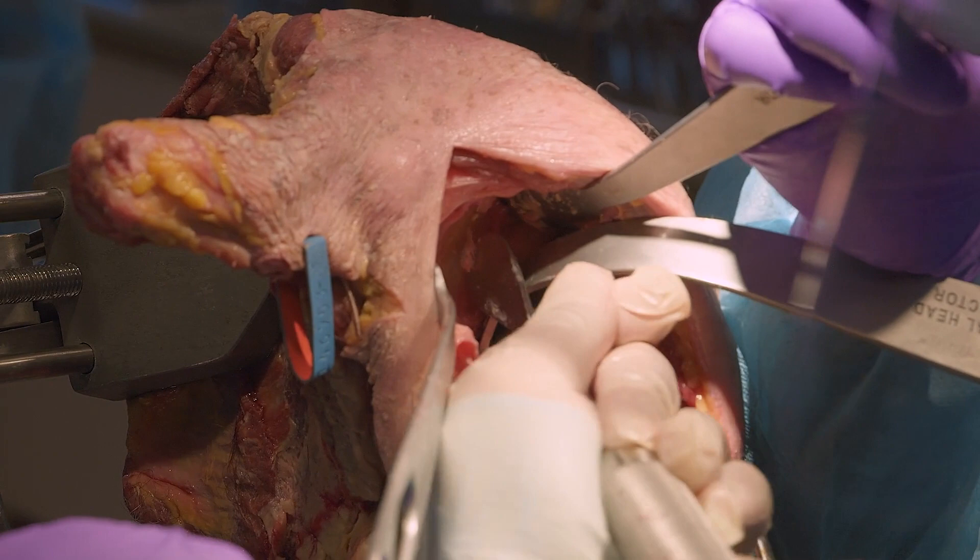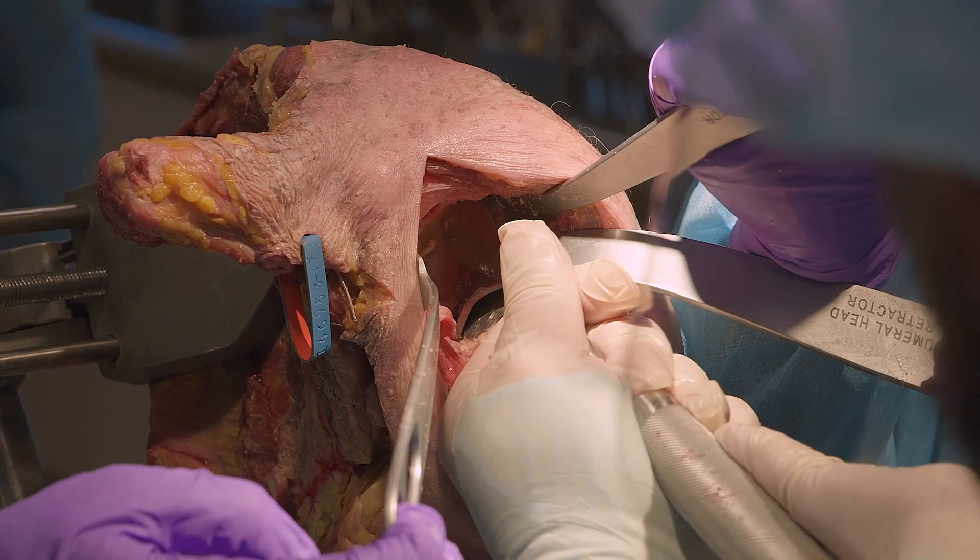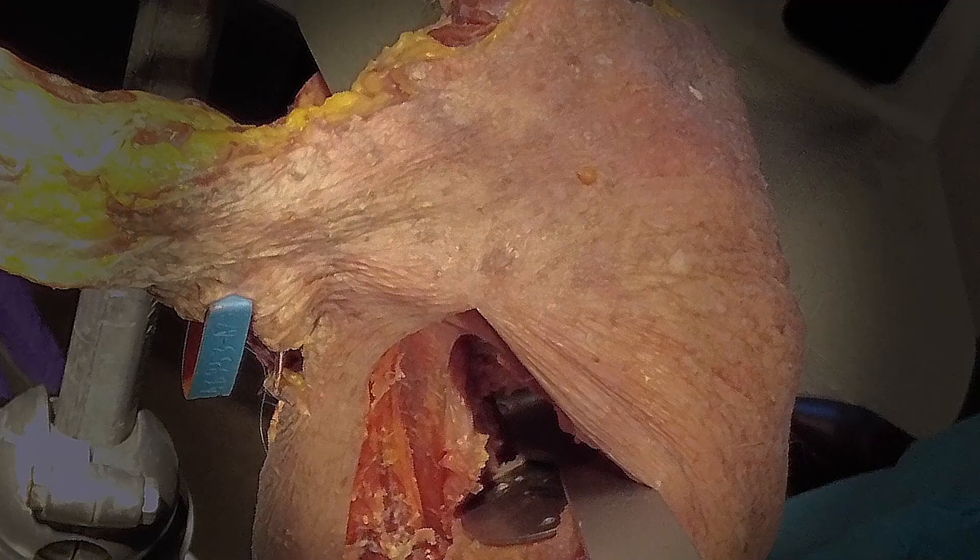This is showing the scraping, which I think is highly recommended. Usually in arthritis there's not much scraping needed, but in this case there was a lot more cartilage than planned.